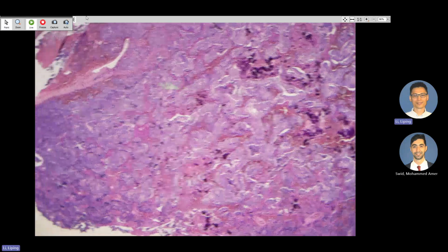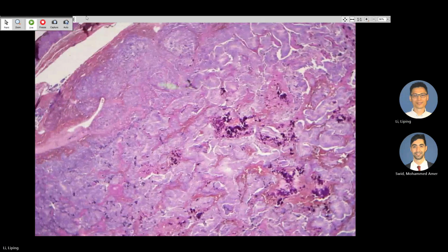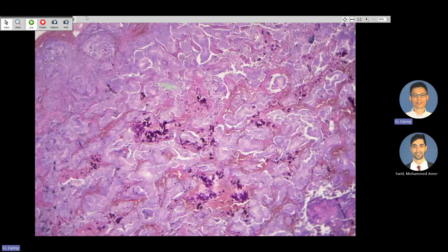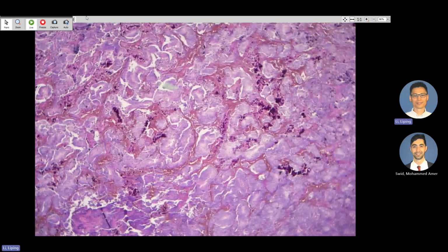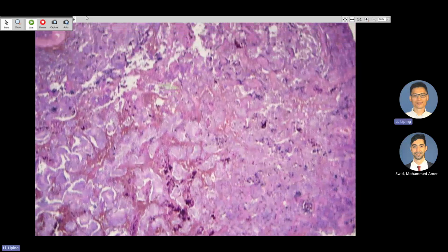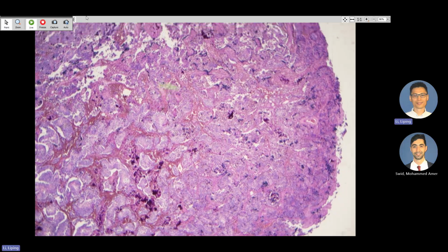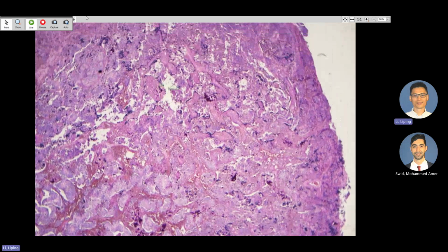So all of these are kind of bluish small cells with minimal cytoplasm, which fall into our small blue cell category. Because we are in this chapter, we are highly suspicious for neuroblastoma because we didn't see any Schwannian stroma. Maybe a little bit here, but I'm not sure, maybe just fibroblasts. We need the staining to tell whether there is S100 positive Schwannian cell stroma.